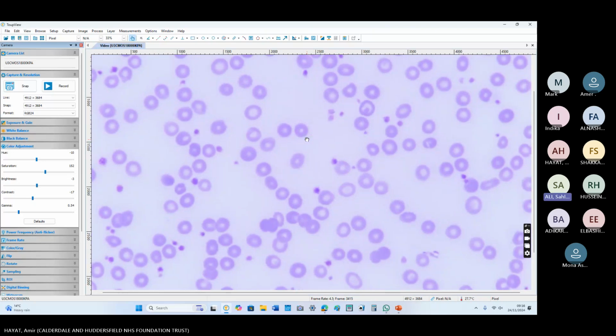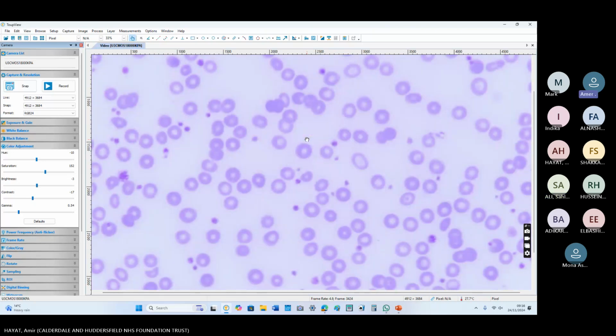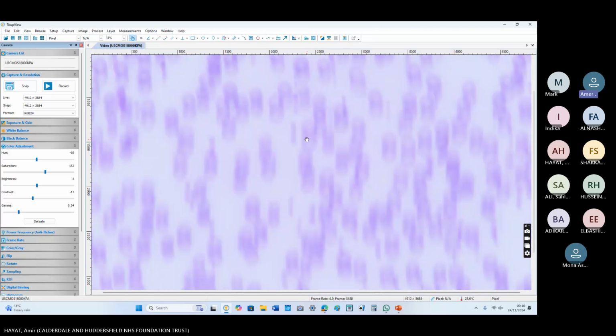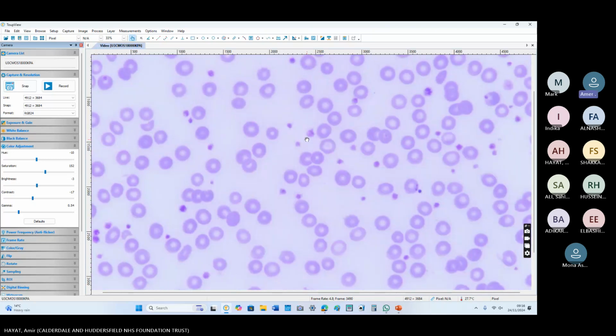Yeah. But as a response to infection, the platelet count goes high always. But if it is a virus thing, viruses always suppress your bone marrow, and there is thrombocytopenia.